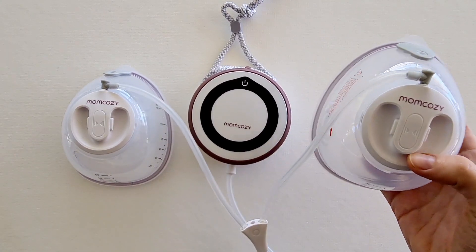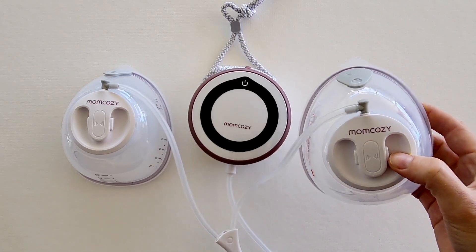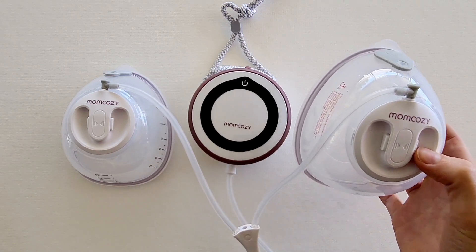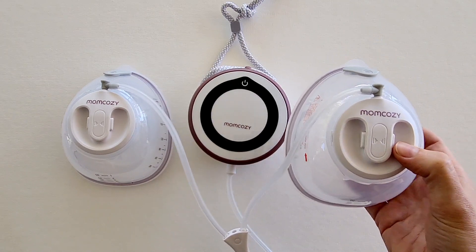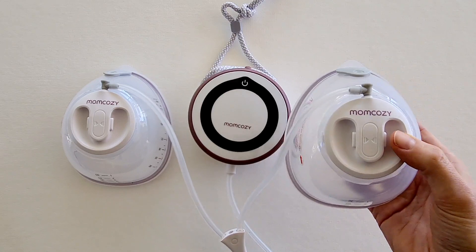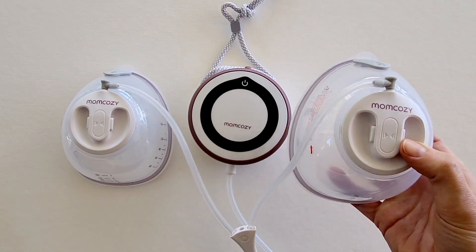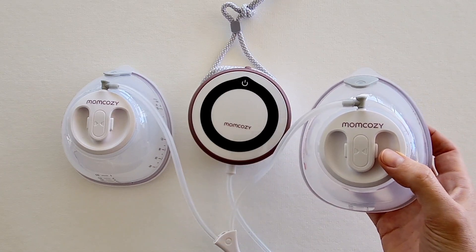The Mum Cozy V1 is a powerful portable breast pump with micro vibration technology. There are a few standout features of the V1 which I absolutely love, as well as some things you might want to consider if this is the right pump for you. So let's dive in and take a look at everything on offer with the Mum Cozy V1.